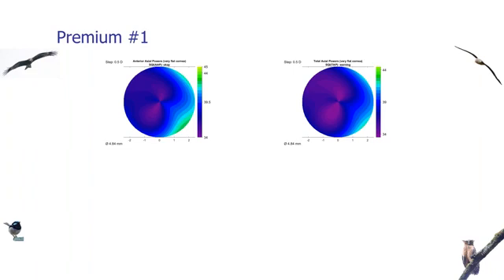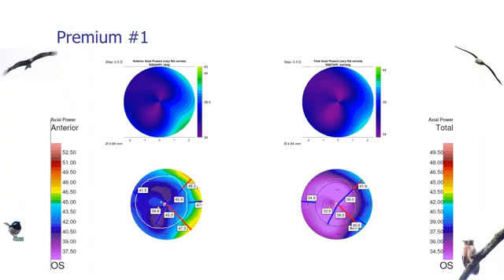The maps are able to tell us, though it's still better to ask the patient if they've had corneal refractive surgery. This is confirmed by the Optiscan. The left side is the anterior axial map which is much higher because it's not a keratometric axial map. The right side is the total axial map which is closer to keratometric. But in this case, this patient is post-myopic laser.